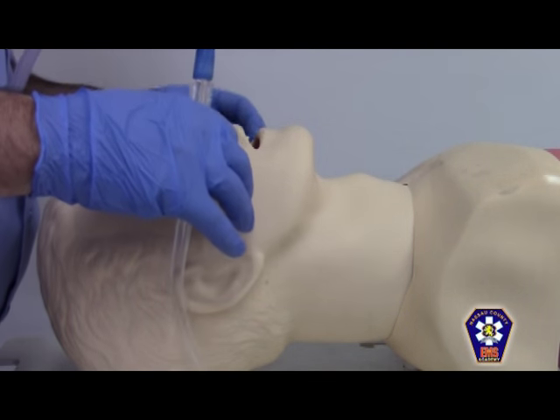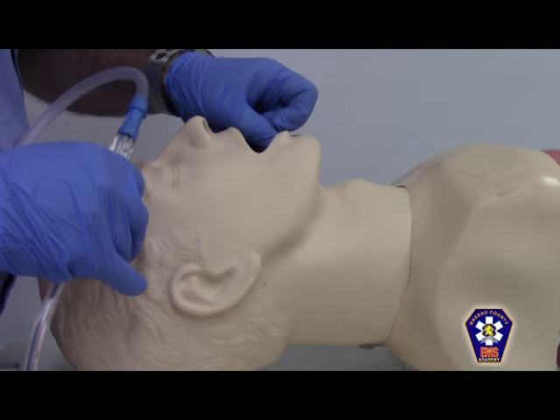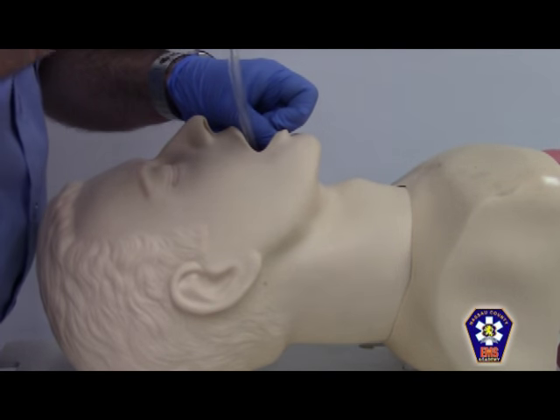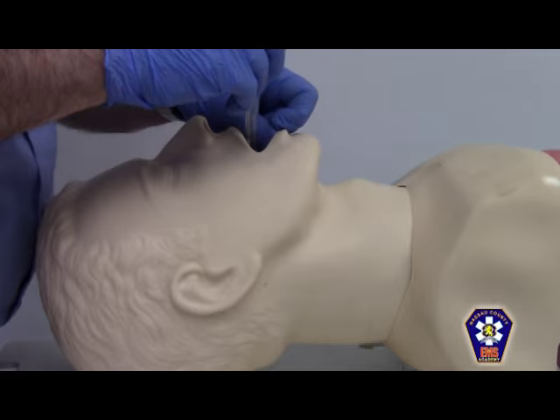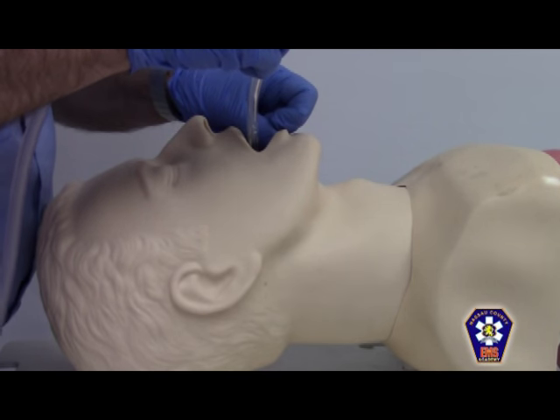With the suction unit on, and prior to actually creating vacuum within the tubing, I'm going to open the airway with a cross-finger technique, enter the suction catheter as far back as I can see, begin suctioning by closing down the whistle-tip, and vacuuming on the way out in a semi-circular or circular motion.